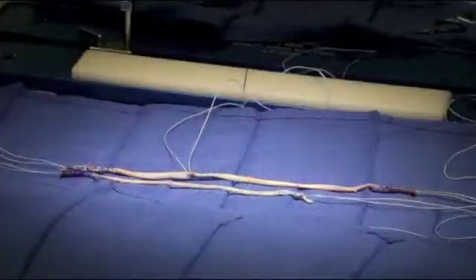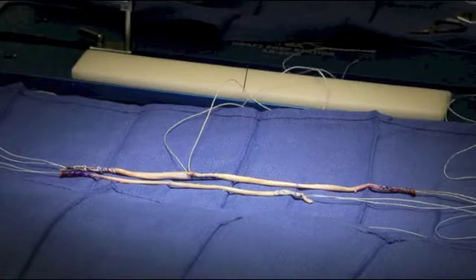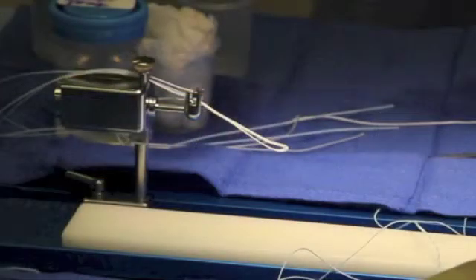Now both grafts are prepped, having been measured, marked, and whip stitched. On the graft prep board, we use an Arthrex ACL Tightrope RT. We will be passing our graft through its cinching loop.